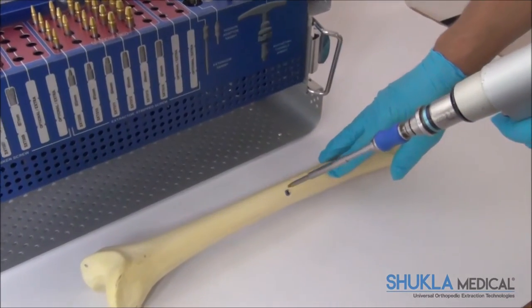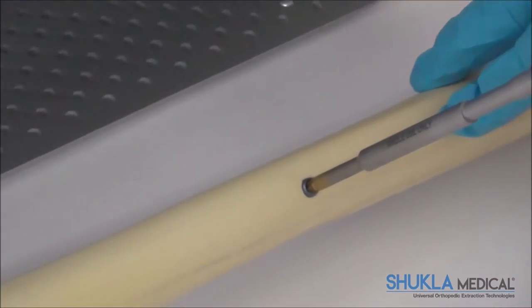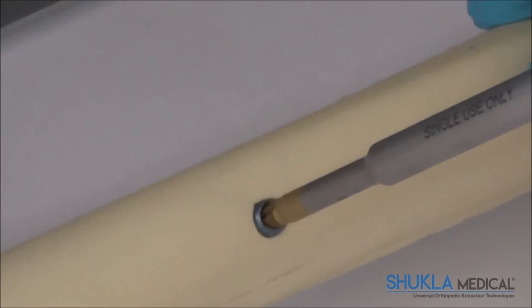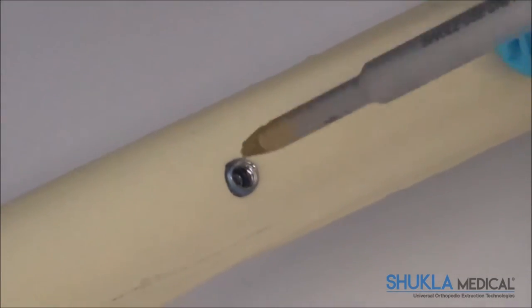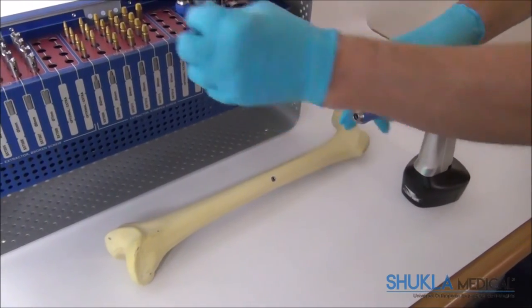After the stripped screw extractor is connected to the driver, the tip is inserted into the screw well that is stripped. The extractor tip should come in contact with the side walls of the screw well, and not touch the bottom of the well. If the tip does touch the bottom of the well, a larger size tip should be used.